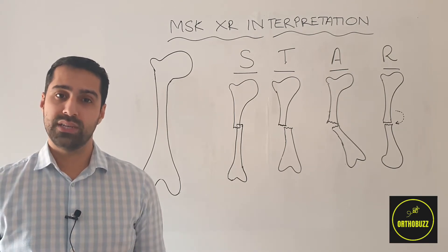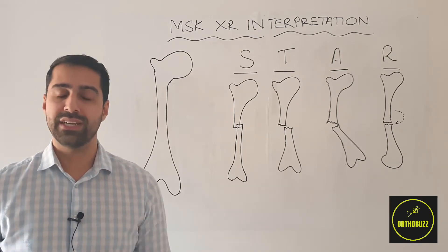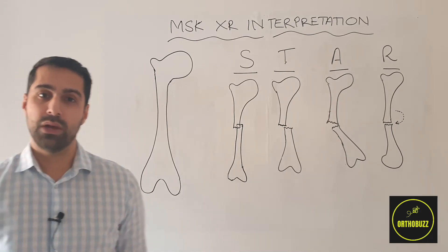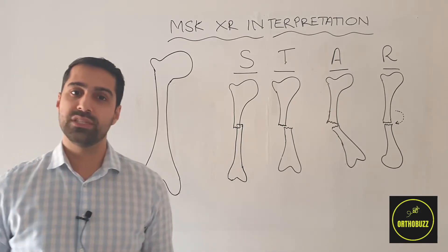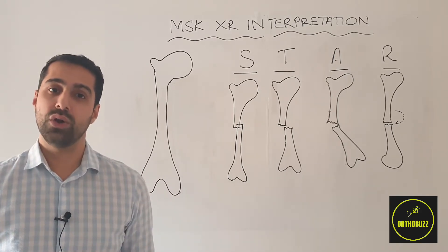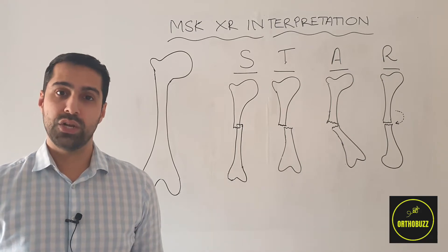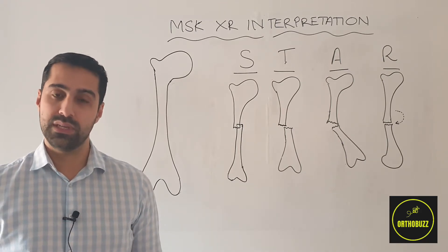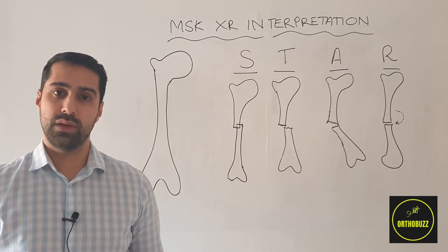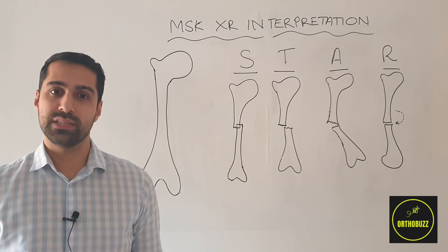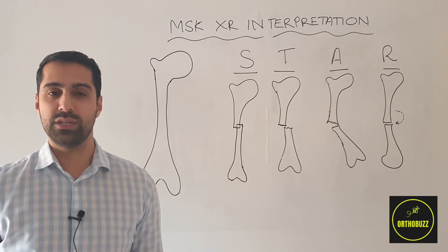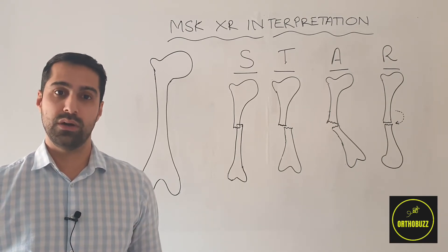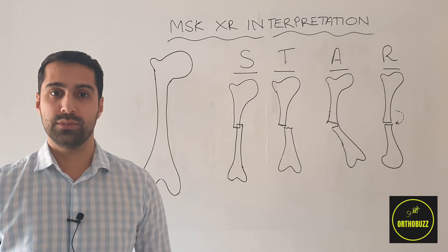Step one: we're going to identify that we have the correct patient and the correct x-ray. This can be done by looking for three points of identification on the x-ray. This includes the name of the patient, the date of birth and the hospital number, as well as confirming we have the correct image for that patient, as they may have multiple images on our x-ray system.